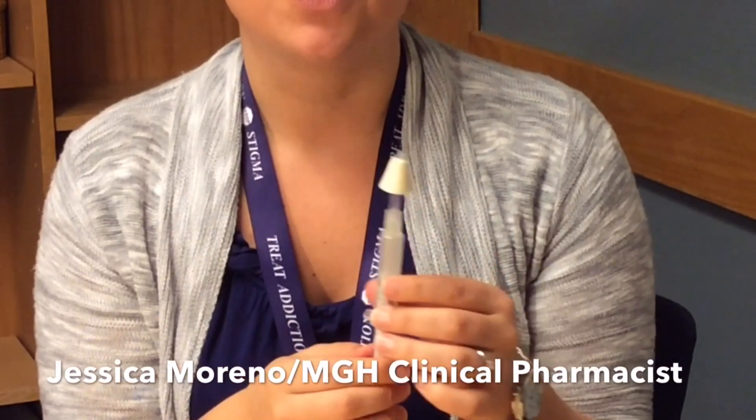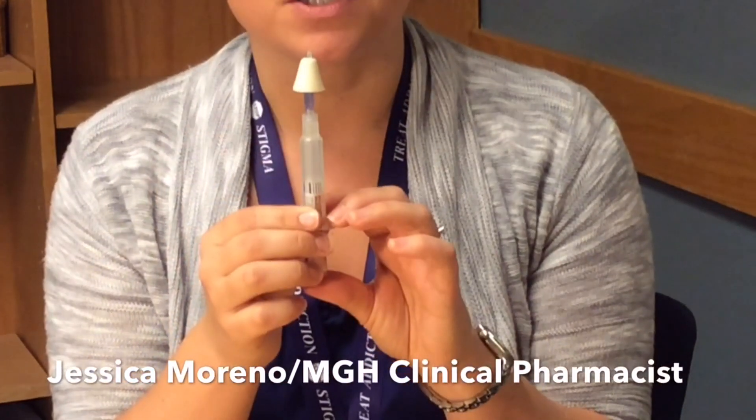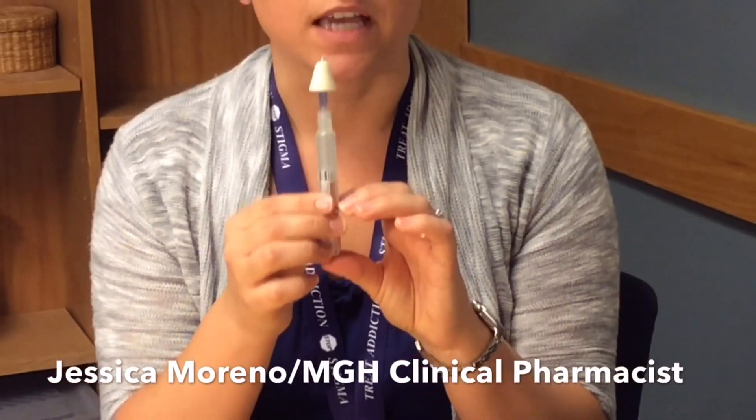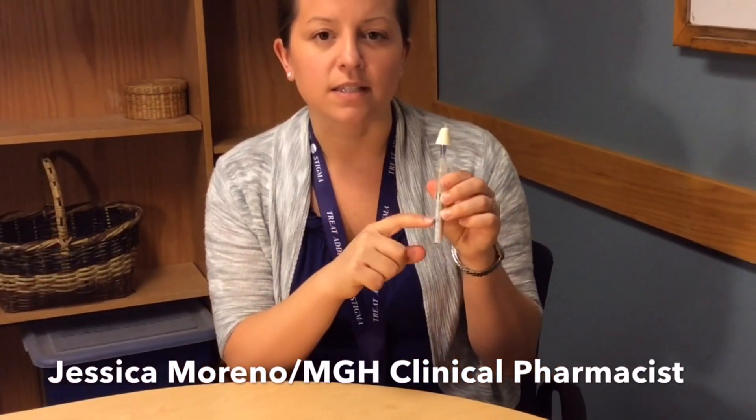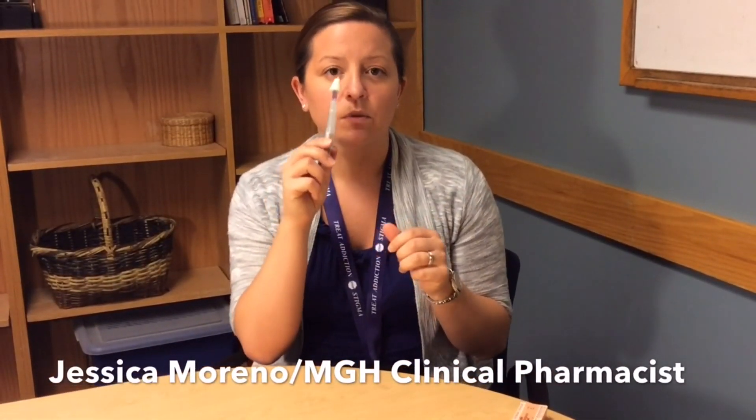To give a dose, you're going to insert the nose piece into one nostril and then squeeze the plunger until about half of the medication has been given. There are little notches on the side of the vial so you can tell how much is about half. Once you've given half in one nostril, withdraw the nose piece, put it into the other nostril of the patient, and give the remaining portion.